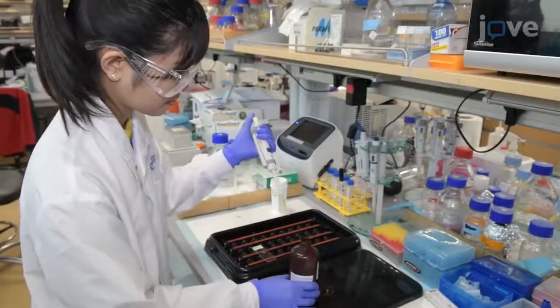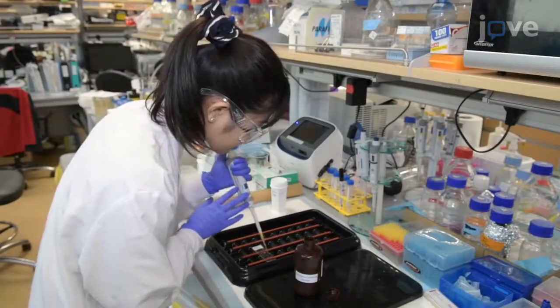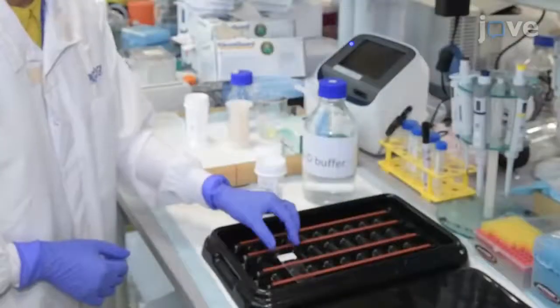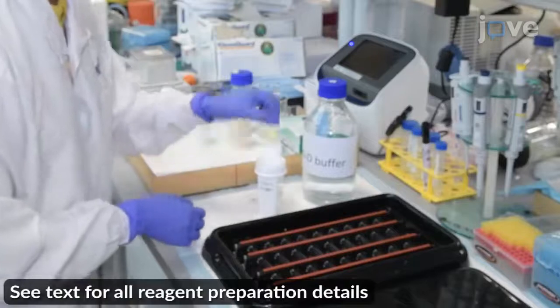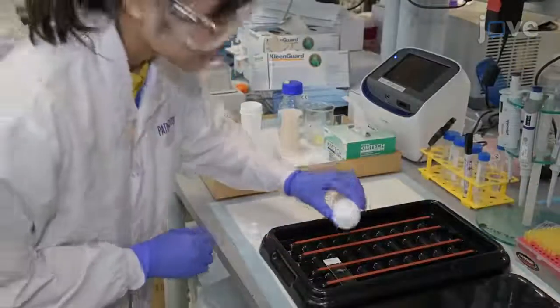When the antigen retrieval solution has cooled, block the tissue peroxidase activity with a commercial peroxidase block for 10 minutes, followed by a 5-minute wash in tris-buffered saline, or TBS, and a non-ionic detergent. Block any nonspecific staining with a 10-minute incubation.